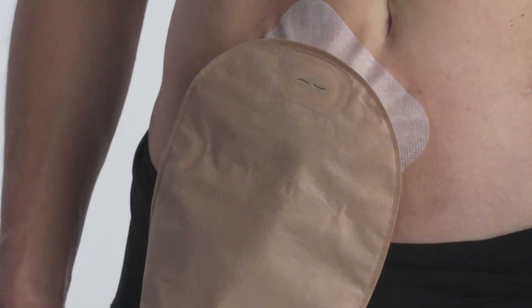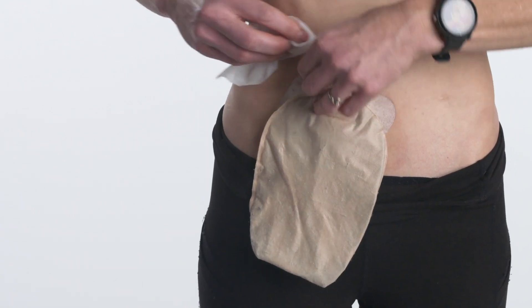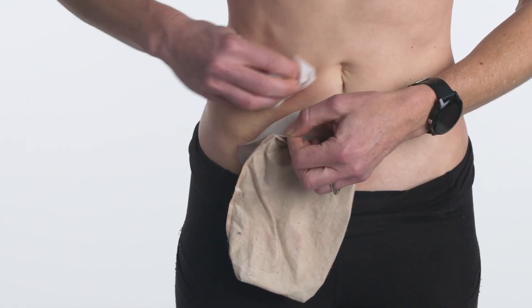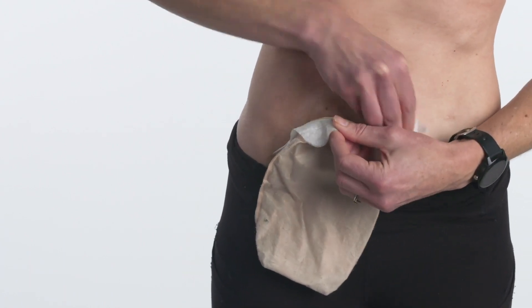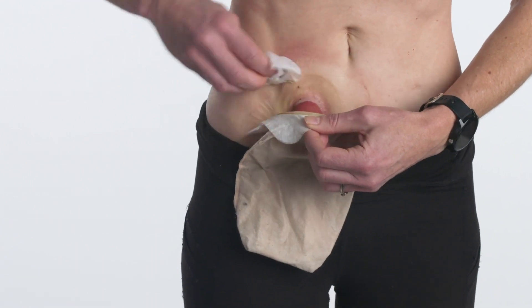To remove the system, clean the surrounding skin with an adhesive remover wipe or spray. In this demonstration, we are using a wipe. Lift a corner of the skin barrier or tape, then wipe the adhesive remover between the skin and gently peel the adhesive down and away while continuing to wipe. With the other hand, push down on the skin above the barrier to aid removal.